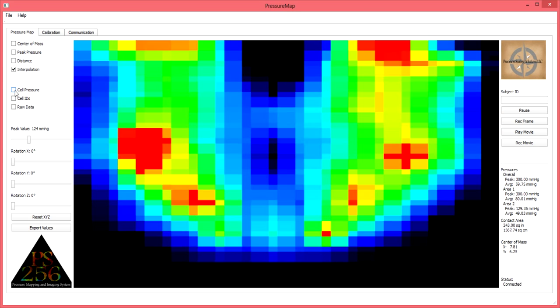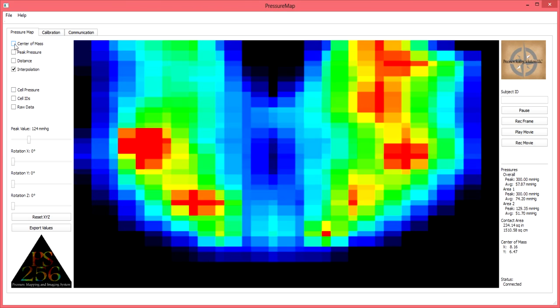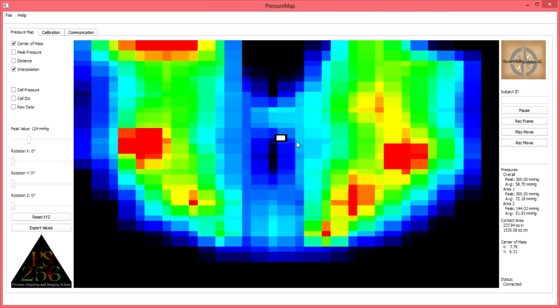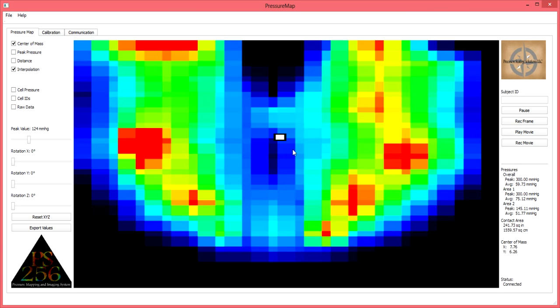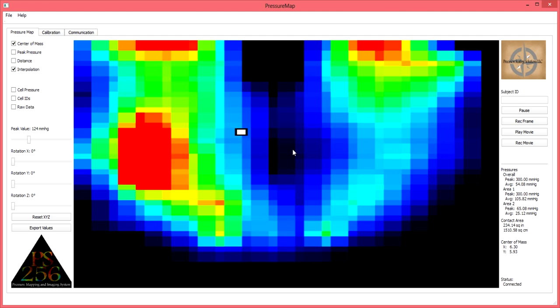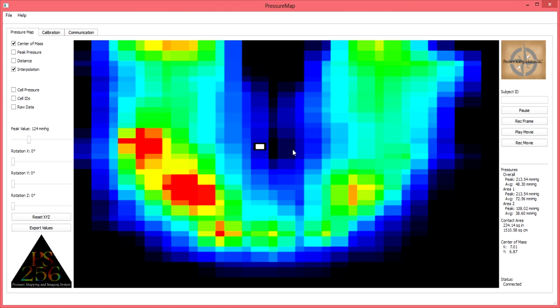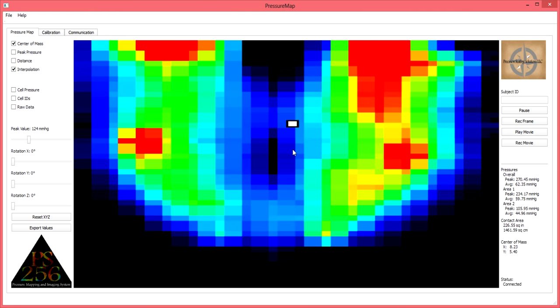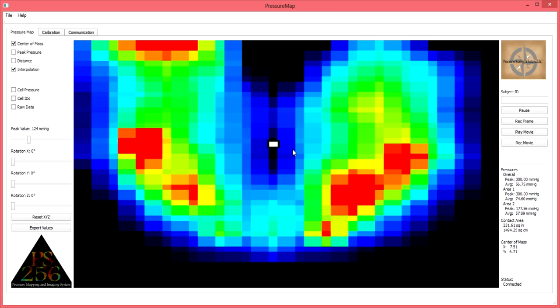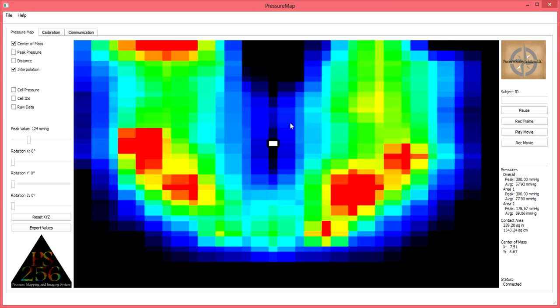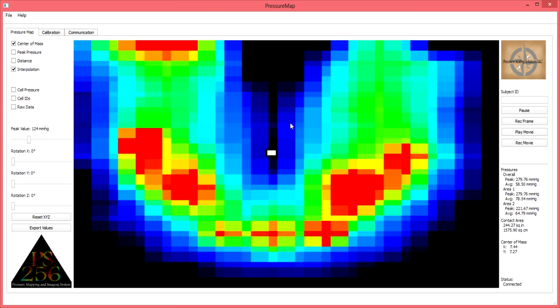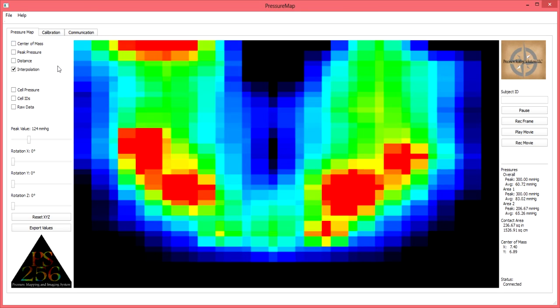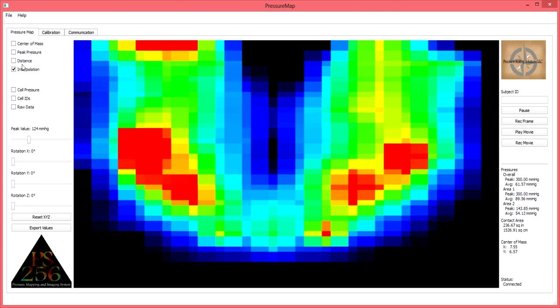Above the peak pressure selection tool, on the upper left hand side of the screen, is the center of mass selection tool. When selected, you will see a small white box with a black outline pop up on the display screen. This white indicator identifies, on a continually updating basis, the location of the client's center of mass. A variety of uses for this feature are discussed in our clinical application tutorial, including several ideas for implementing the PS256 into a billable treatment plan. To turn this center of mass feature off, deselect the box next to this tool.